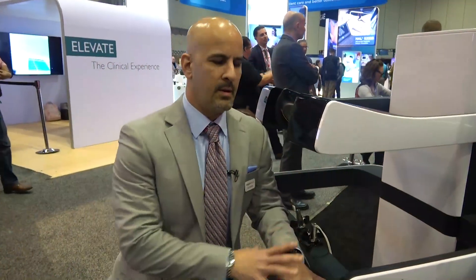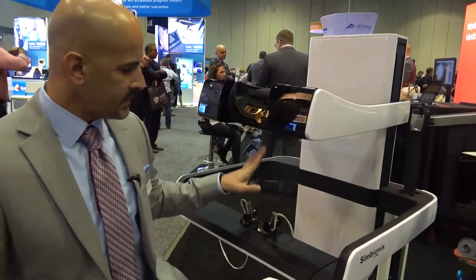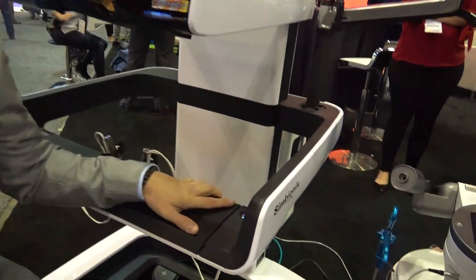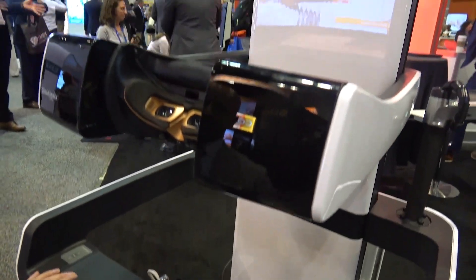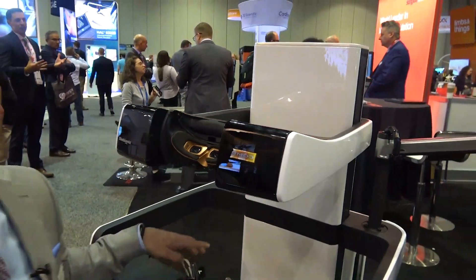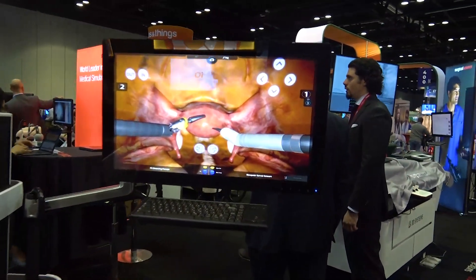This is the Robotics Mentor. This simulator mimics the Da Vinci robotic surgery system and allows doctors to practice in a robotics environment using very similar ergonomics to the real robot. What we see on the screen is one of our gynecological procedures for hysterectomy.